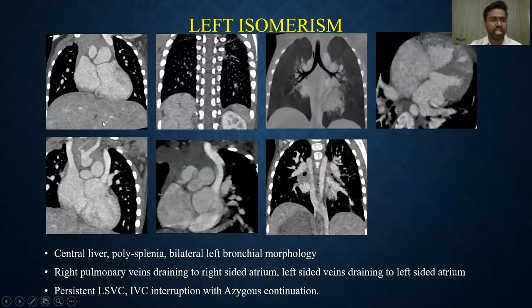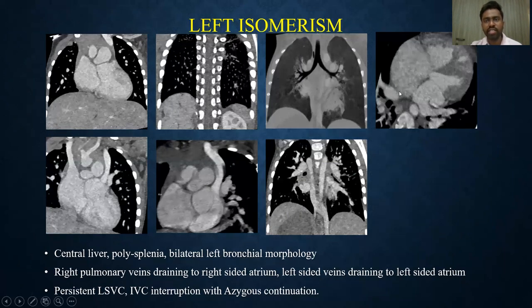Coming to the left isomerism case: the liver was centrally located with multiple lobulated spleens indicating polysplenia, and the bronchi showed bilateral left-sided morphology with bilobed lungs. The right-sided veins drained into the right atrium and the left pulmonary veins drained into the left atrium. This patient also had a persistent left superior vena cava and IVC interruption with azygous continuation of IVC.